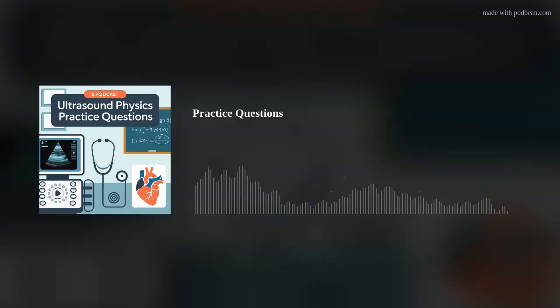Okay, let's revisit those acoustic variables. We talked about them before, but this question wants a bit more detail. What are they, and why are they so important in ultrasound? Acoustic variables are basically just characteristics of a material that can affect how fast sound travels through it and how the sound waves behave. The main ones are temperature, distance, pressure, and density.